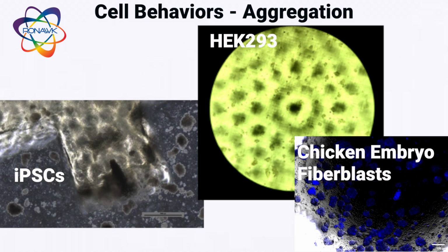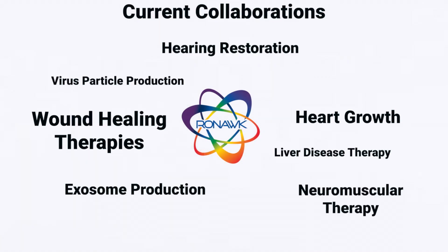As of the fall of 2023, tissue mimetic structures have been grown from approximately 50 different cell lines for a wide range of usages.